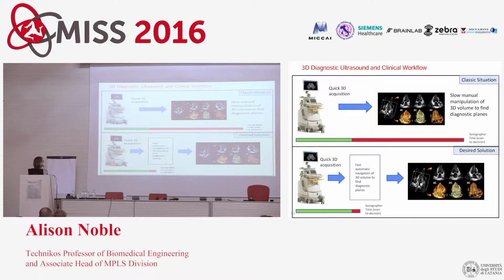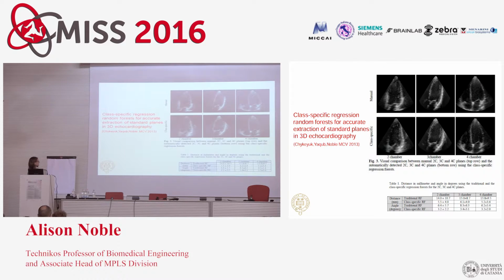So the interest in our field at the time was how we go from 3D acquisition and use image analysis to automatically find these planes. You acquire data, quickly do the plane finding, and then recover the diagnostic planes. Only when you do this do you start to introduce a solution that's going to be acceptable in clinical practice.